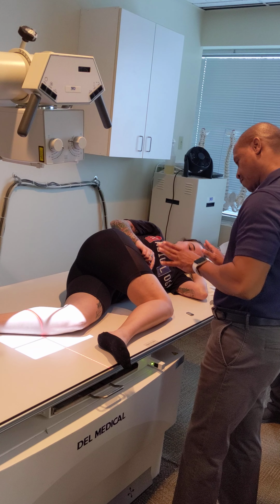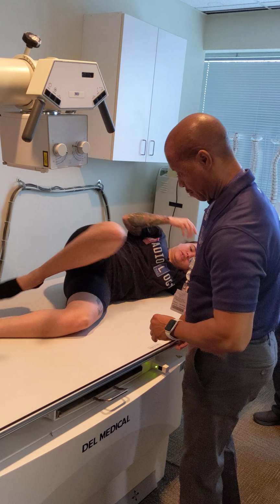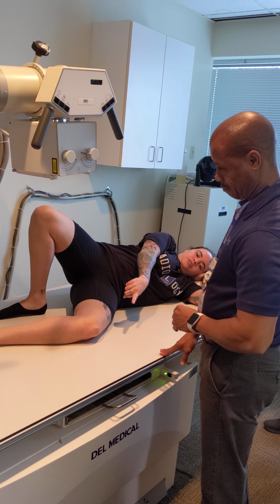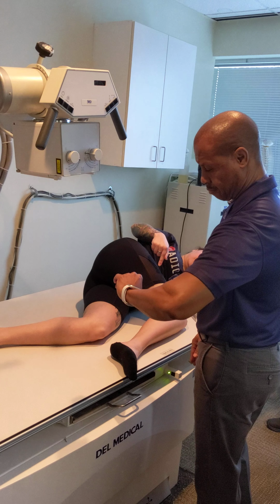This one's fine. And also, 9 times out of 10 out in clinic, this is going to be comfortable for almost all your patients, because not everyone's going to be flexible enough to do this to where you get the knee flat enough. If you need to get the knee flat, they might rotate their leg in like this. So 9 times out of 10, your patients doing this is.